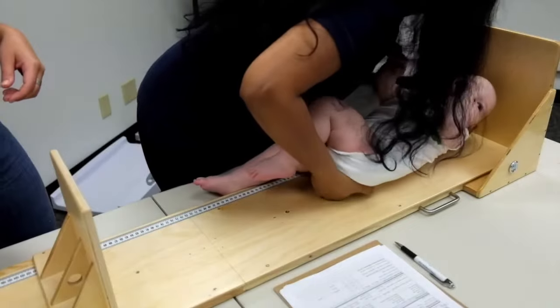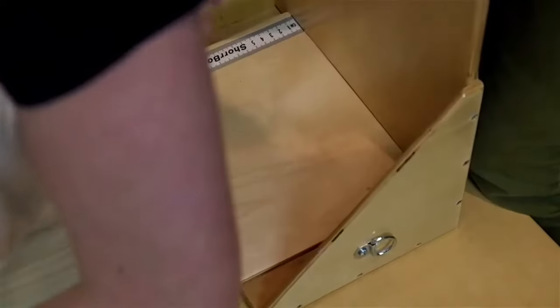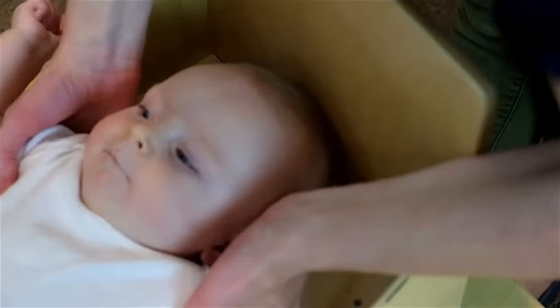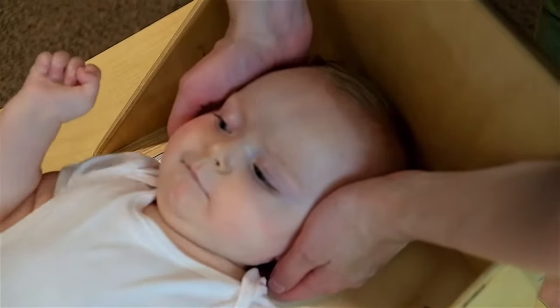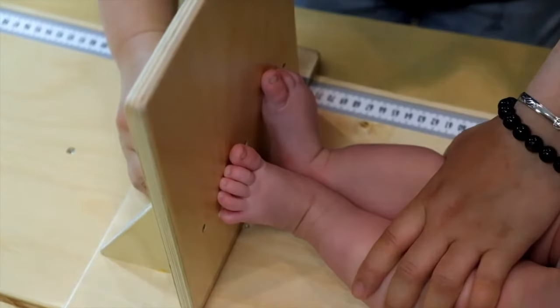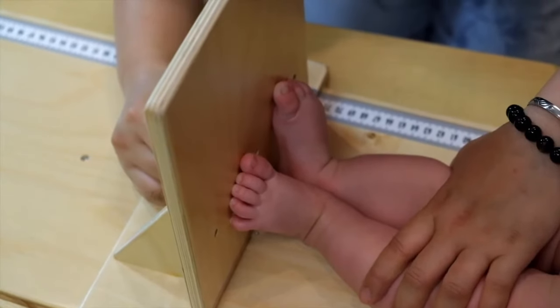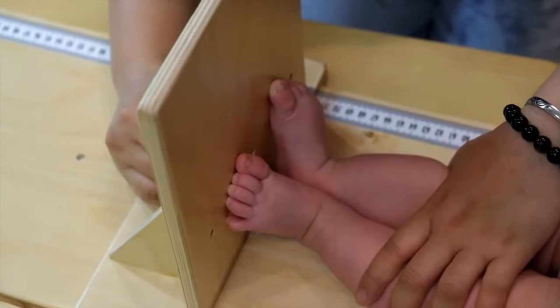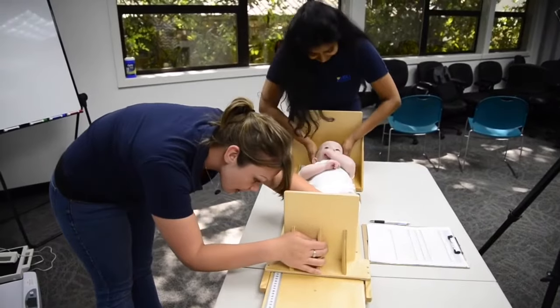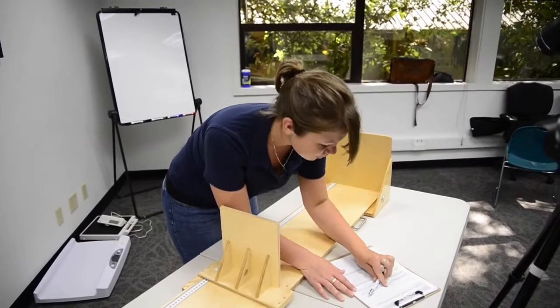Length is measured for all children under two years old, regardless of their ability to stand. The assistant will position themselves behind the child's head, holding the child's head perpendicular to the base of the board. As the lead obtains the measurement, the assistant should talk to and comfort the child. The lead will be at the child's feet, holding the child's legs straight, then push the sliding board firmly against the child's feet. Make sure the child's feet are flat. Put eyes level with the measurement tape and quickly read the child's length. Immediately record the measurement to the nearest decimal while the assistant tends to the child.